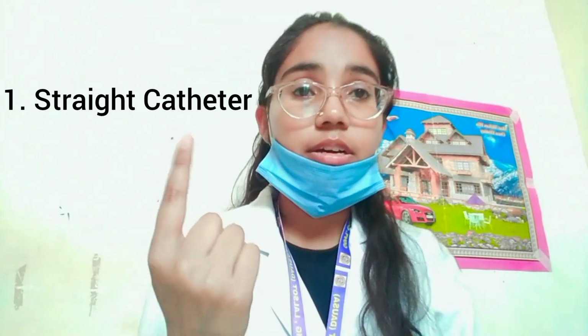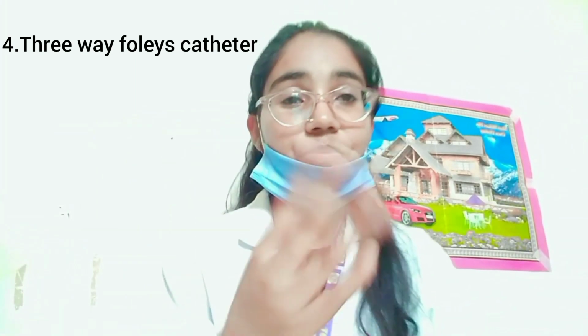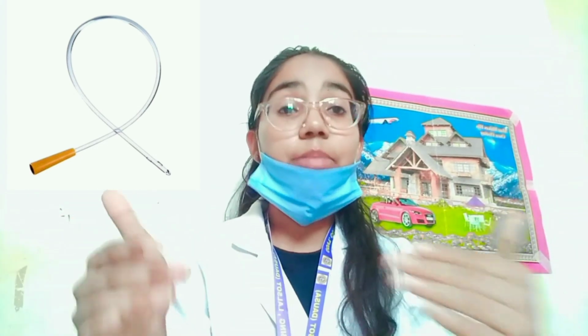There are generally four main types of catheter: straight catheter, Coude catheter, Foley's catheter or retention catheter, and the fourth one is the three-way Foley's catheter. Now we will discuss these catheters one by one. So first is the straight catheter. A straight catheter is generally used to drain the urine but is removed immediately after emptying of the bladder.